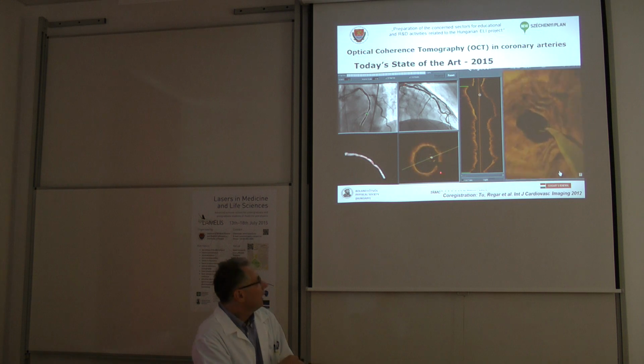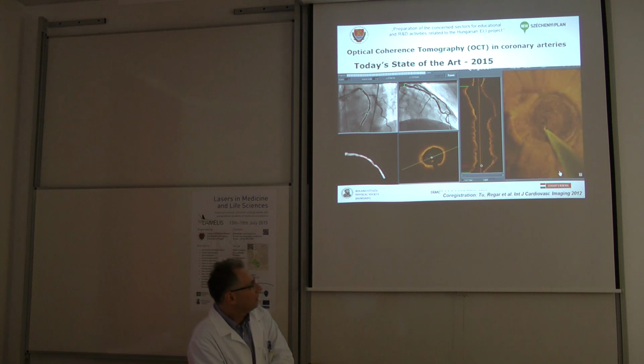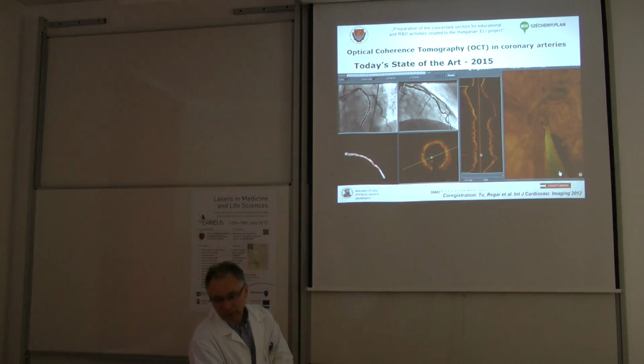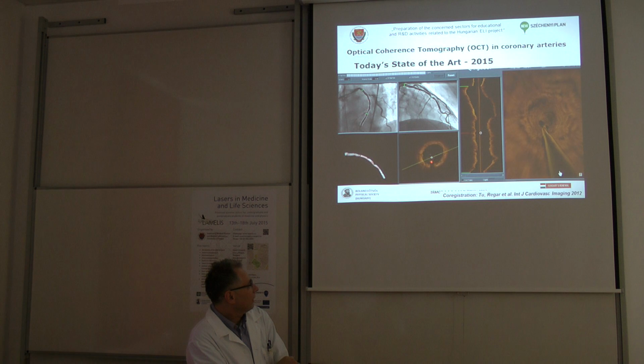So when the OCT lens used to be the image wire itself, in the first generation, it was not there. But since they reconstructed this catheter, it is always there.